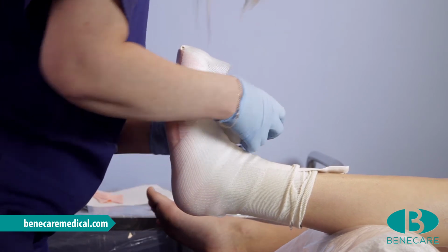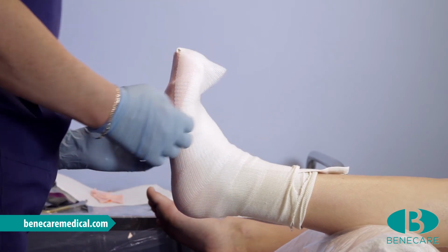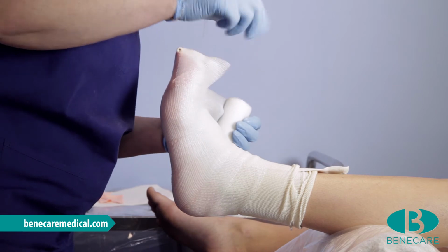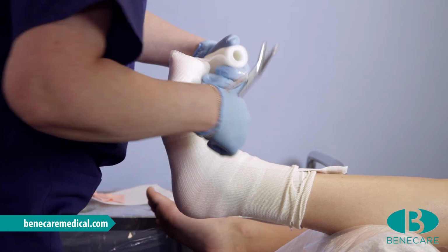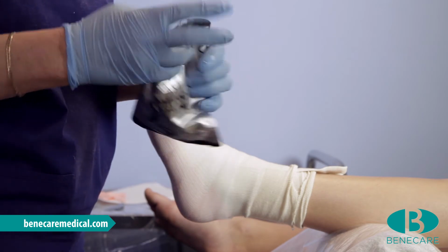Continue wrapping circumferentially across the flexor surface, working towards the toes, covering the previous turn by 30 to 50%. This will provide a minimum base layer of 1, possibly 2 layers. Cut the roll at the toes and place back into the pouch.